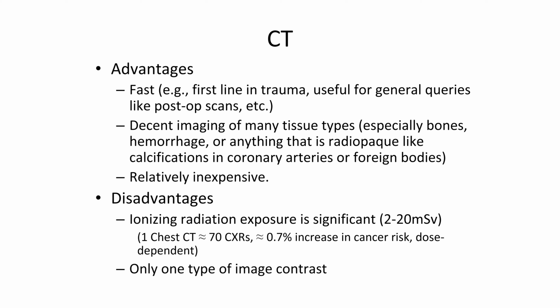You can even go on medical mission trips to Africa and have little transient clinics that have CT scanners. And so CT scanners are really useful because they're basically ubiquitous, they're fast. You can use them for all sorts of just quick general inquiries, especially in trauma. So typically people will be scanned to see if there's any major organ damage, broken bones, things like that, any major hemorrhages. And in comparison to most of medical care, it's relatively inexpensive.